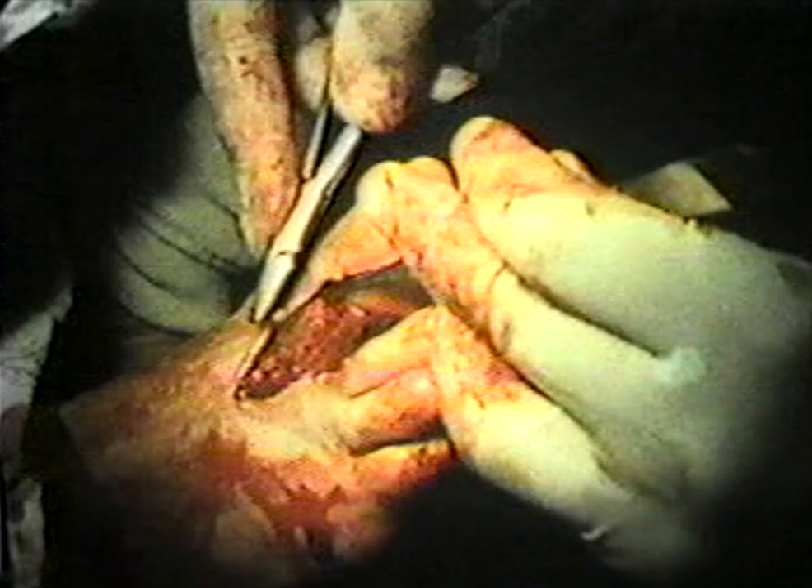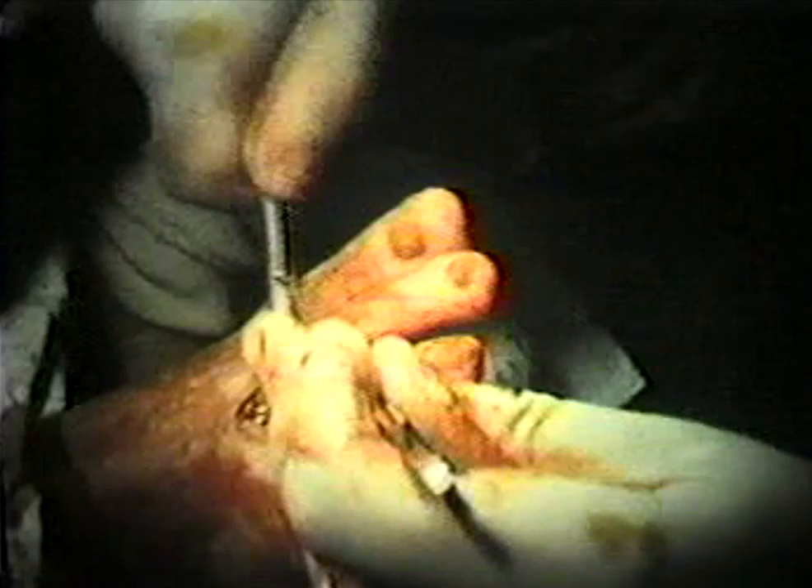The wound is closed in layers. We use 2-0 Dexon deep, 3-0 Dexon deep.